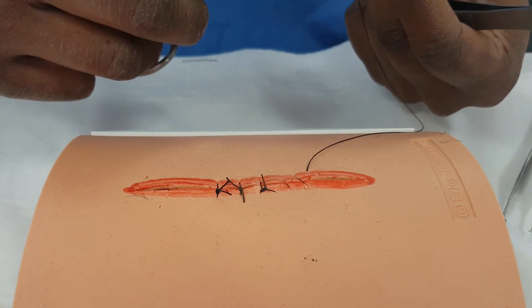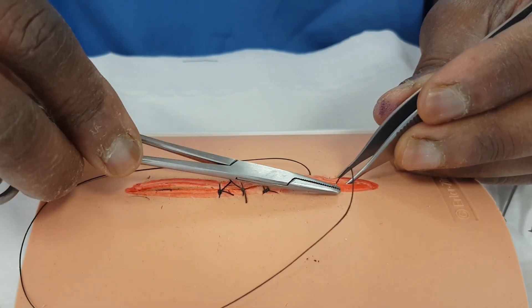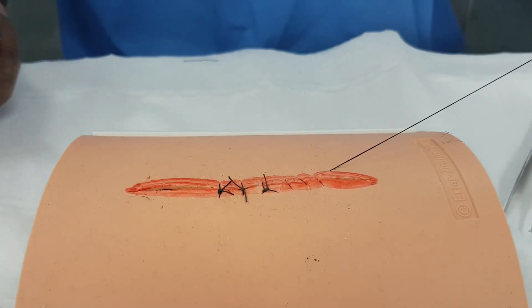We'll put a third one in there, and it should do exactly the same. I just come straight — I don't bother changing any angles. All I do is bring my stitch through, and as I do that, it will lie against that. And you can see that's coming along there, and that's going to close very nicely.